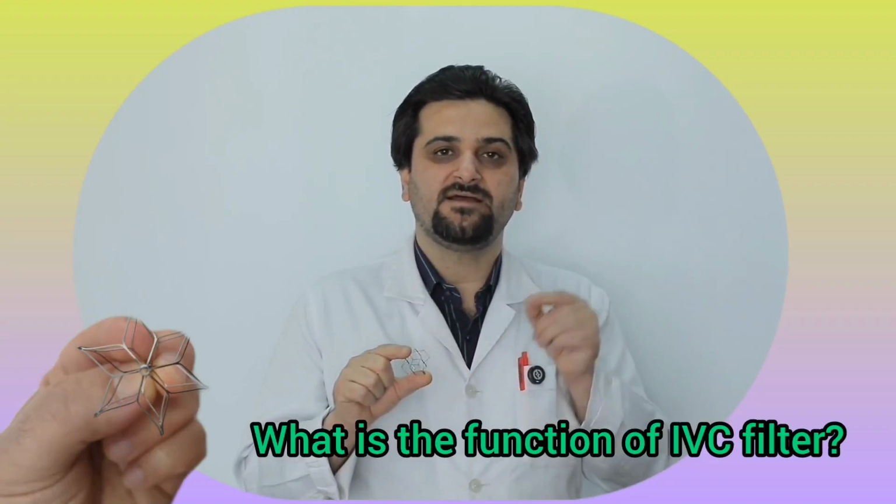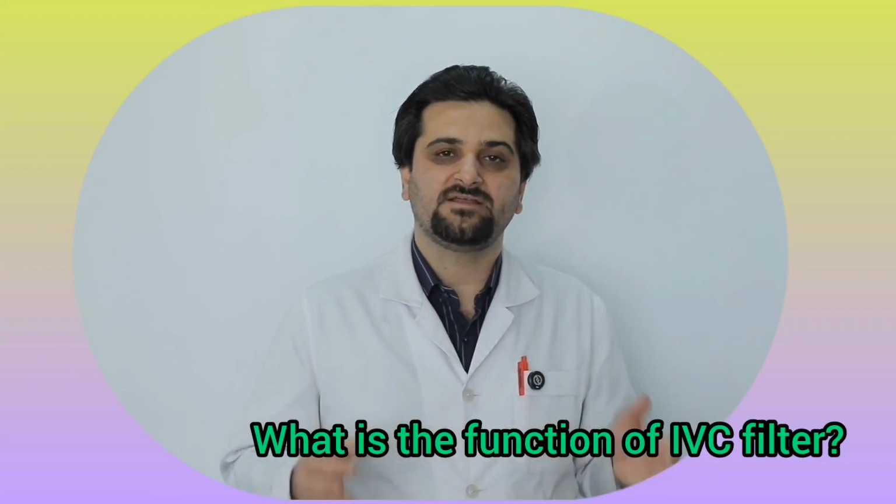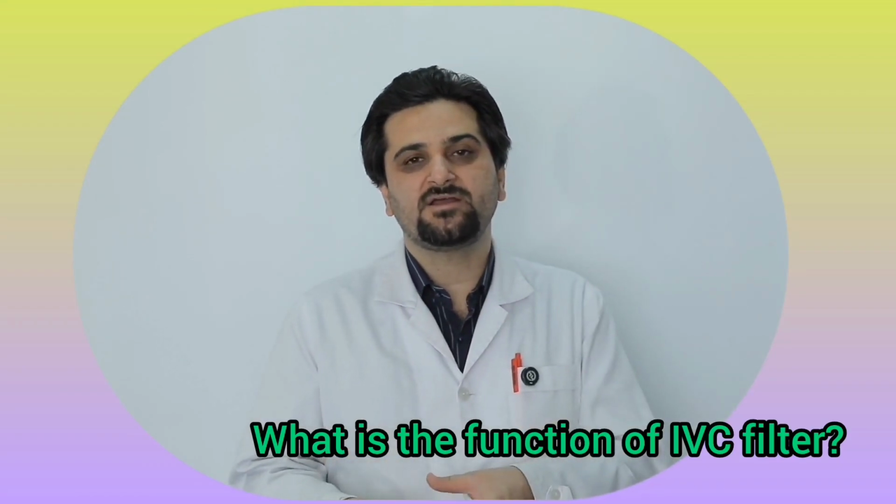As its name suggests, the IVC filter is placed in the IVC, or inferior vena cava, and it prevents the movement of thrombi and clots that accumulate in the lower limbs and are supposed to travel to the heart through the IVC. Therefore, it prevents pulmonary embolism.